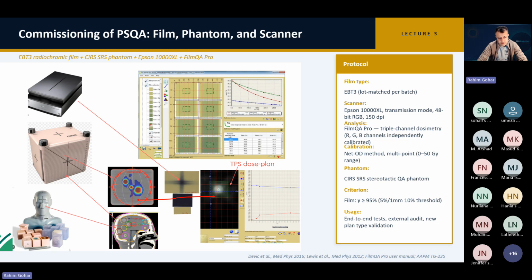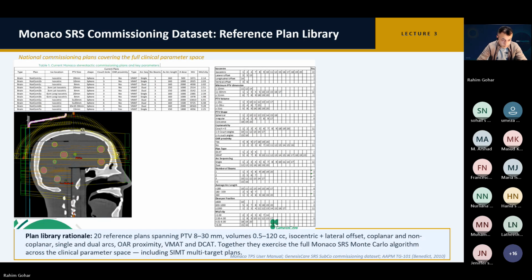If you have the measured dose and the TPS dose, you can overlap them, because while irradiating these planes, you can define where your centering mark is, and then you can find out the gamma analysis. It is time consuming, but it's doable. So for any new system, any new center, this is recommended.